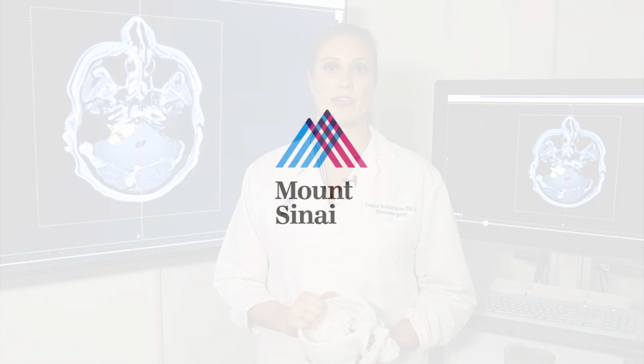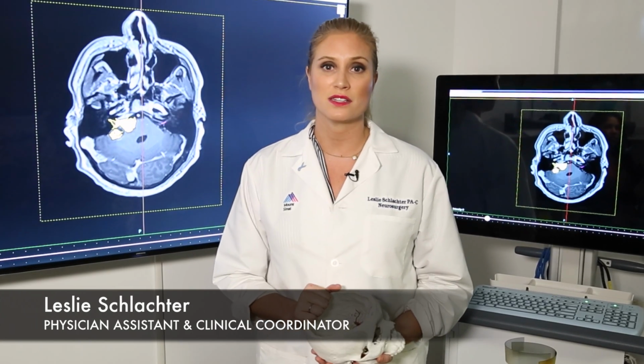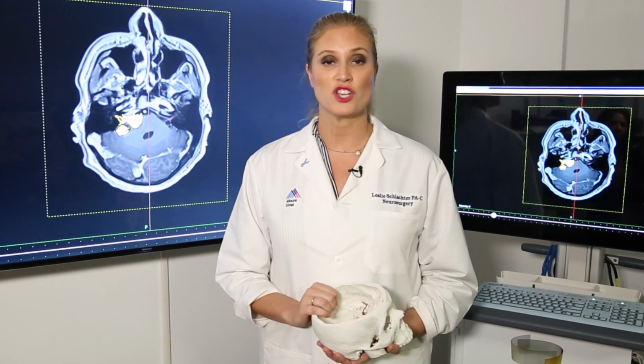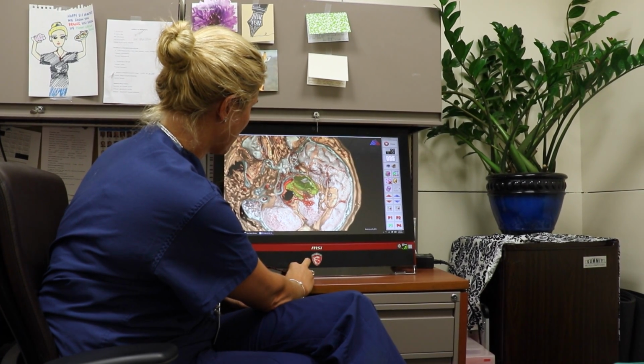No two patients are the same. Every tumor can be a little bit different in size, location, and consistency, which prompts us to need to change the way that we prepare for surgery. Right about here is where a lot of the cranial nerves start coming out.